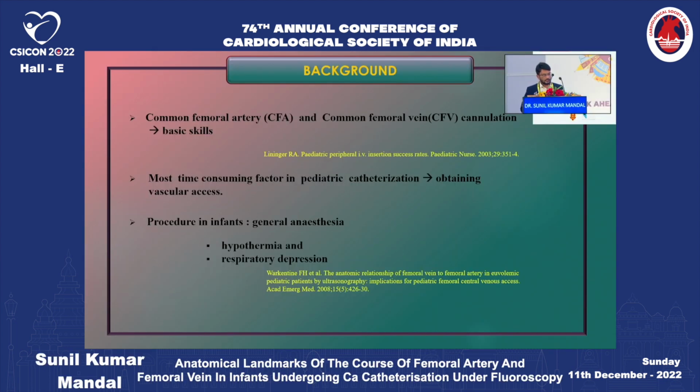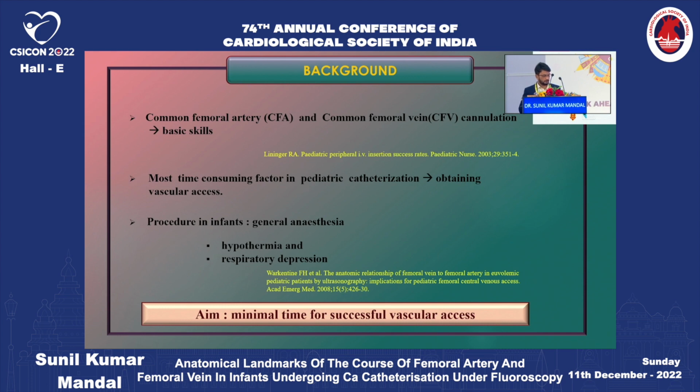Common femoral artery and common femoral vein cannulation is considered a basic skill and is frequently done in the cardiac cath lab. It is the most time-consuming part of pediatric catheterization, because in infants we do the procedure under general anesthesia, so a prolonged procedure can lead to hypothermia and respiratory depression. Keeping this in mind, our aim should be to minimize the time for successful vascular access.